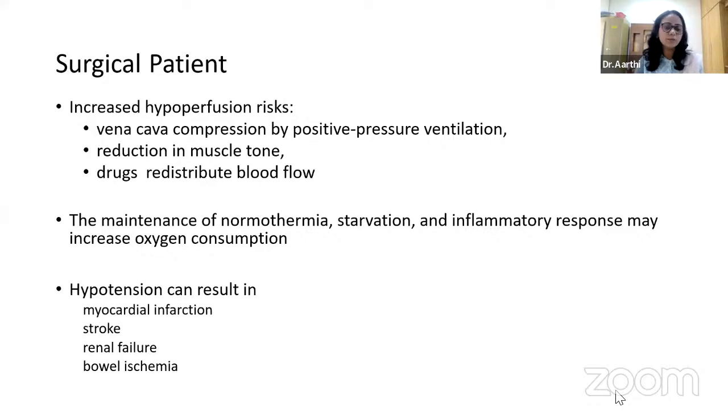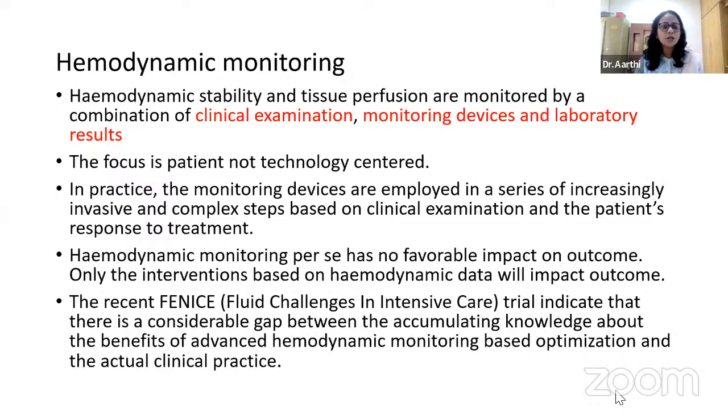Why are we worried about these circulatory disturbances? They cause secondary organ dysfunction like myocardial infarction, stroke, renal failure, and bowel ischemia. Hemodynamic monitoring should include a combination of clinical examination, monitoring devices, and laboratory results. The focus is always about the patient, not the technology. In practice, monitoring devices are employed in a series of increasingly invasive and complex steps depending upon the clinical examination and the patient's response to treatment.